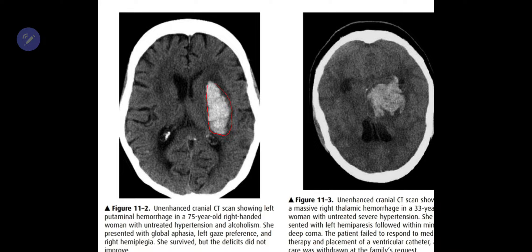On the left you can see this white area — a hyper-dense area, whiter than the surrounding brain matter. That is a bleed in the left cerebral hemisphere, left basal ganglia of this patient. This little dark rim around it is cytotoxic edema accompanying this particular bleed.